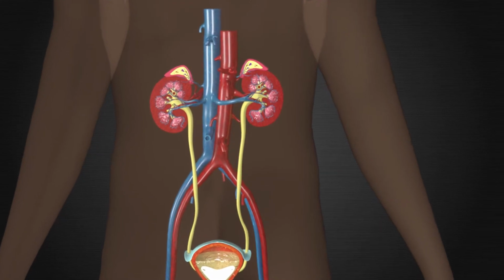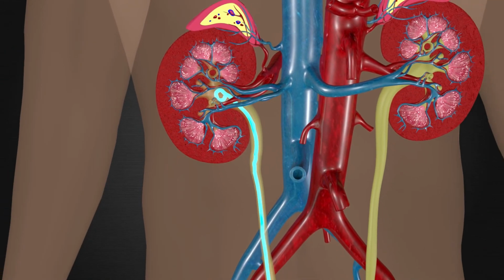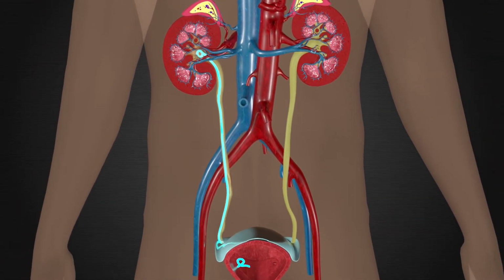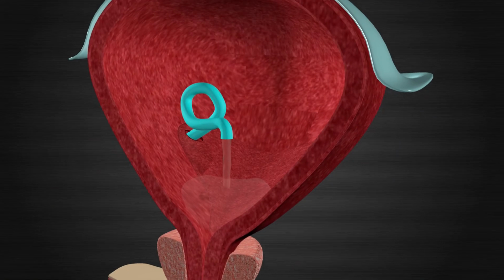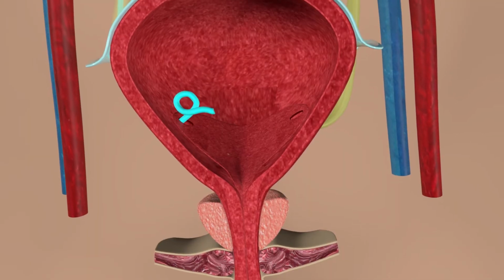Once this is complete, we will then place a stent that goes from your kidney to your bladder if we think it is necessary. In some cases, it may not be needed. This is a small plastic tube that allows your kidney to drain well. If you didn't have it, your ureter could swell, causing slow drainage of urine, which would cause flank pain similar to what you experienced with the stone. You cannot see the stent from the outside of your body. It is all on the inside.